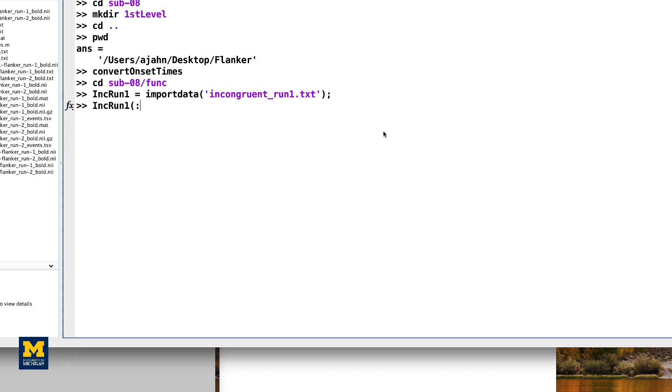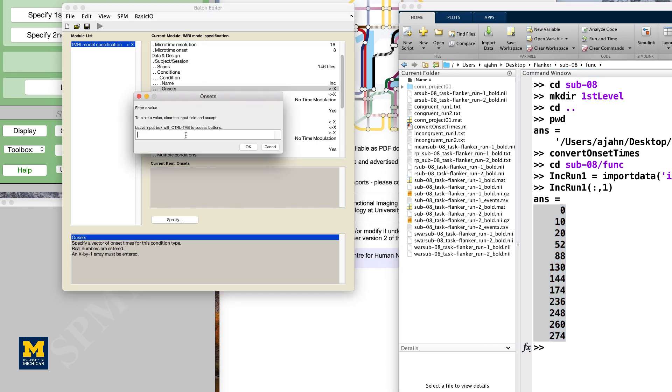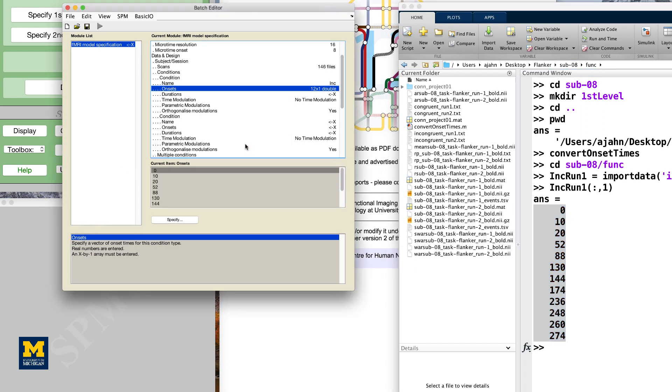If you then type inc_run1(:,1), this will return the onset times for the incongruent condition of run1. Copy the onset times, then double-click on the onsets field and paste the timing values. Click Done.